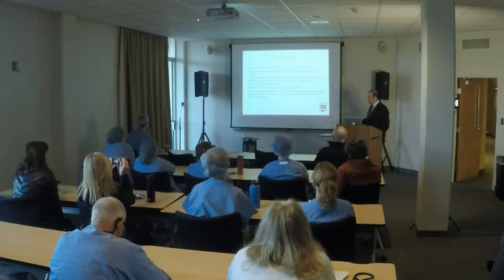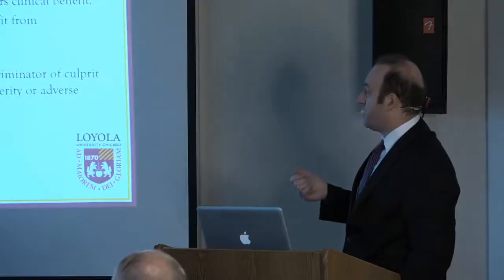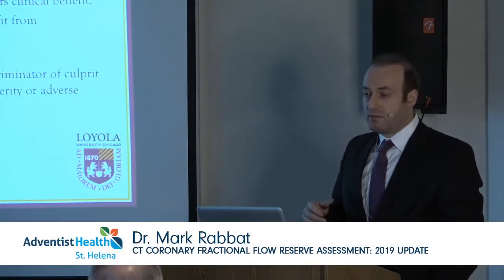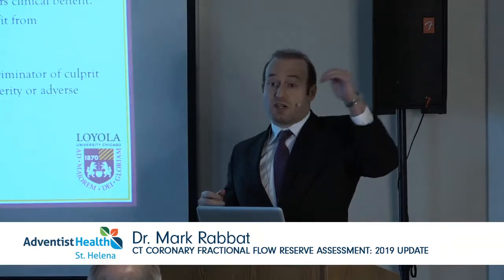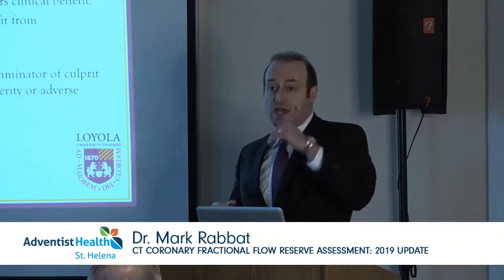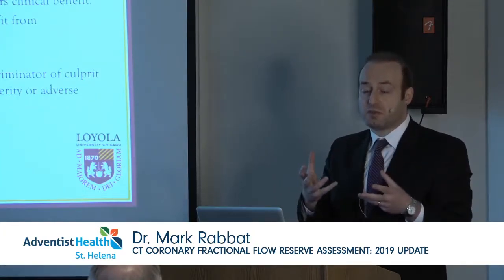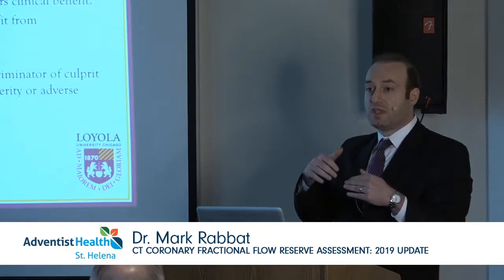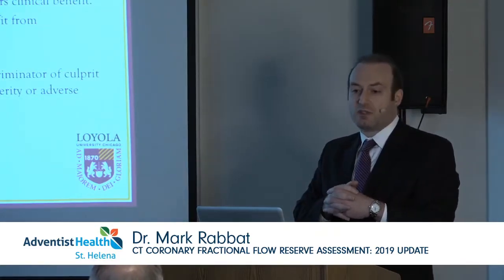So I think what we're going to see in the US with more widespread adoption with FFRCT is a major transformation in the cath lab. I think what we're going to see is a major reduction in diagnostic caths, and the cath lab is going to be transformed into an interventional suite, whereby we're sending the appropriate patients to go to the cath lab to get revascularized and not just take a look. And I feel like that's the way it should be.